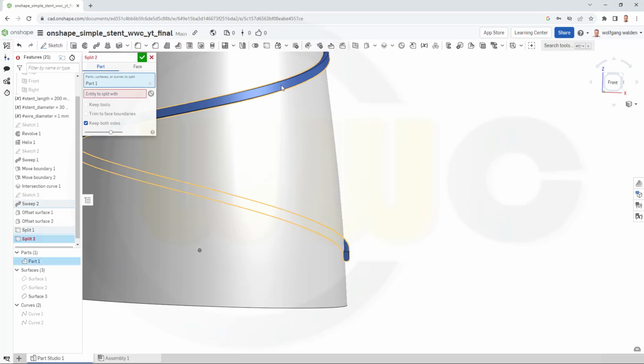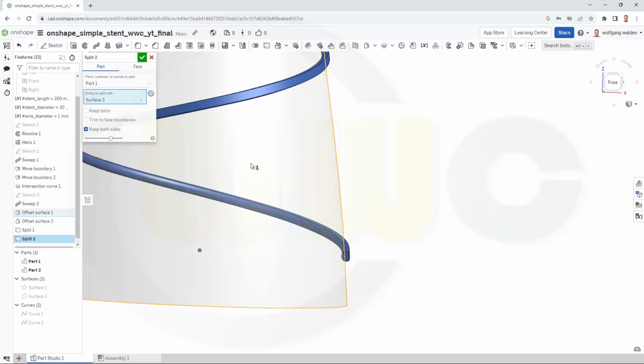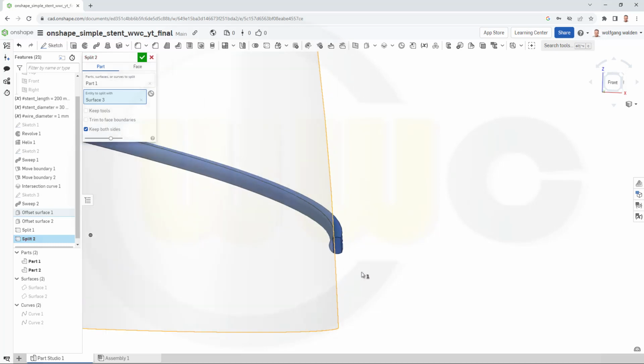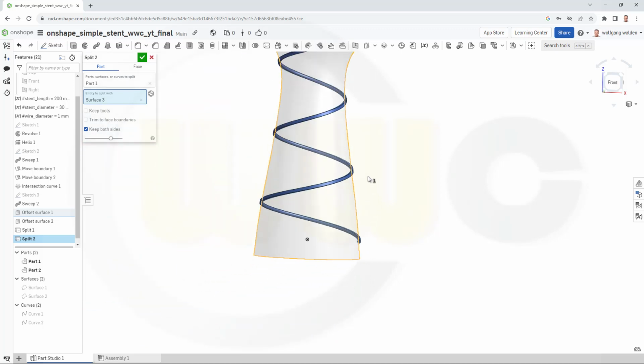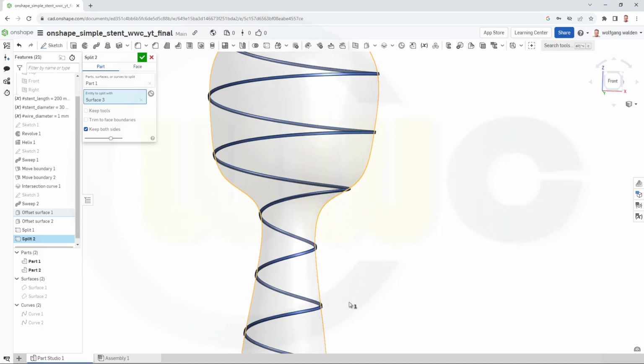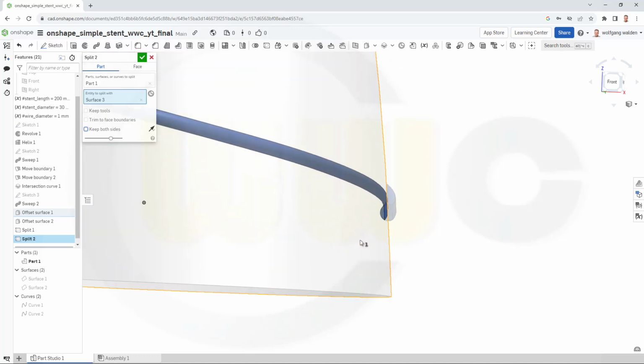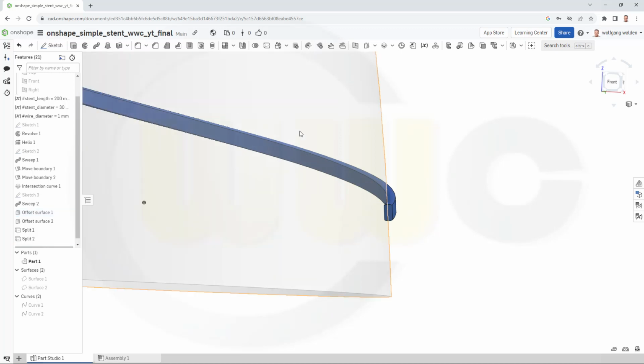Split now the part with this surface. And that's hard to see. There's somewhere an arrow. Sadly not. I don't want to keep both sides. Let's take a look. So I have to switch, which should, that's it, and confirm.